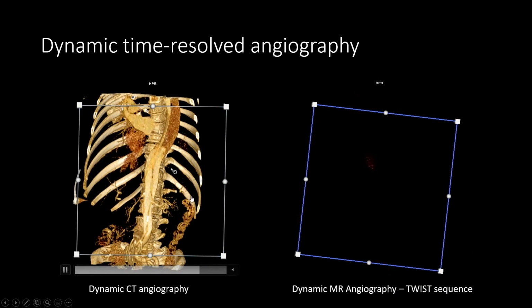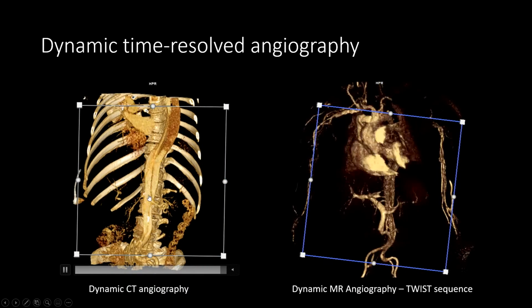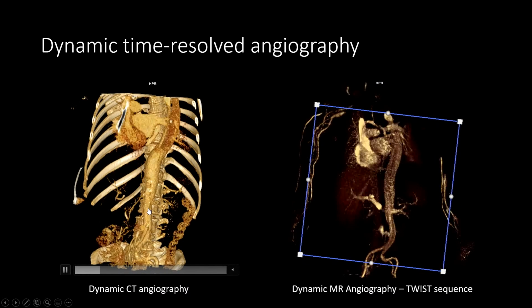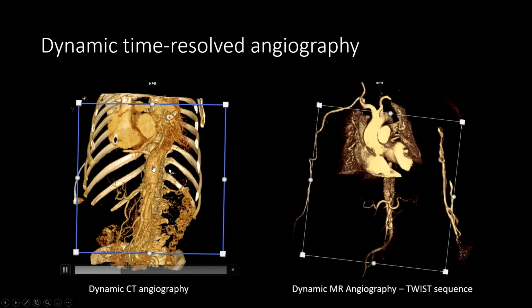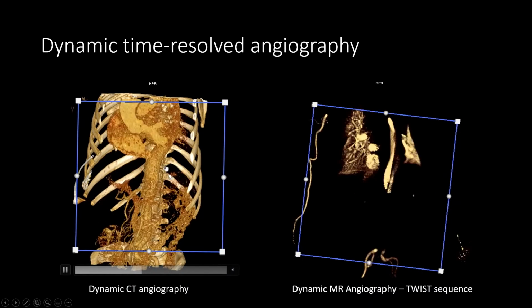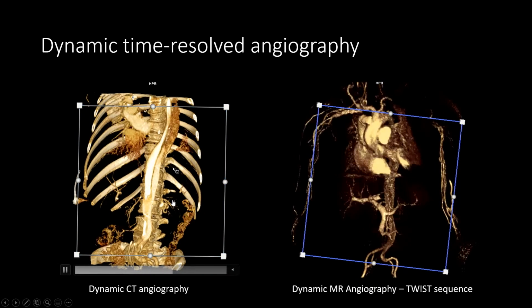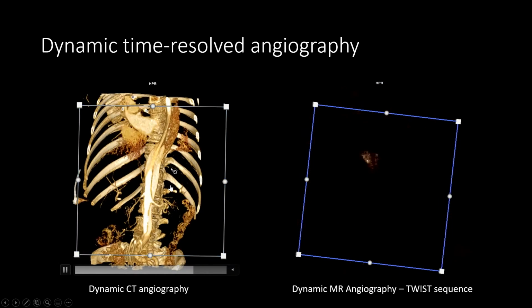And it's the same patient who underwent TEVAR and an EVAR to seal or close the entry tear in the infrarenal aorta. And once you have the device in there, especially if you start to put in non-nitinol based devices, then our post imaging with MR gets affected a little bit. So in this particular patient, we got a post imaging dynamic CT after this.